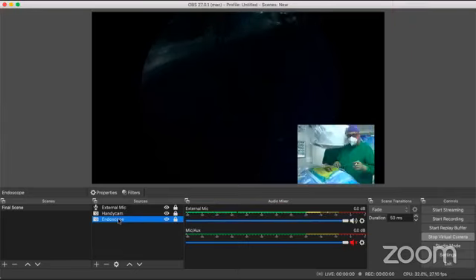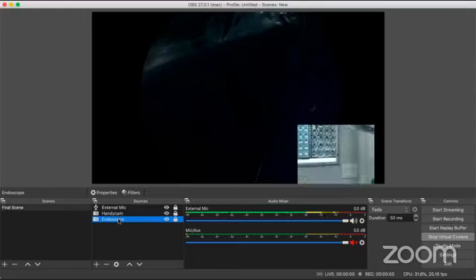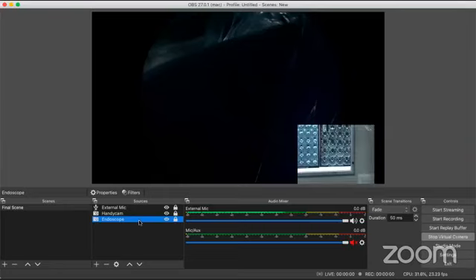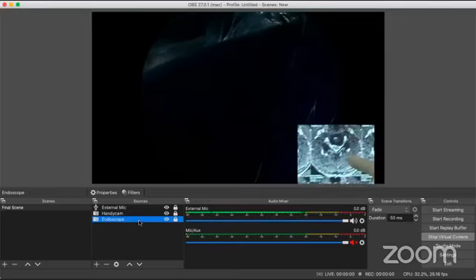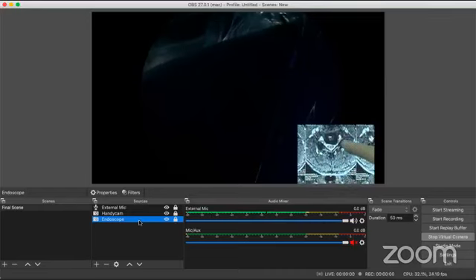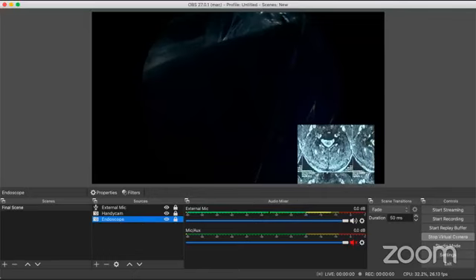Now, I will first take you to the CT scan and MRI, and I will show you what I'm planning. This patient is 47 years of age. For the last 7 years, he's been having severe unremitting pain in his left hand. Focus on this image where you can see my finger. This is a C5, C6 disc. There's a huge disc here, which is compressing the nerve root on the left-hand side.